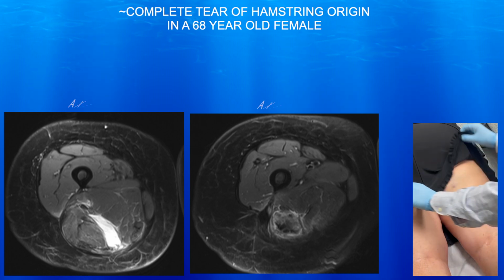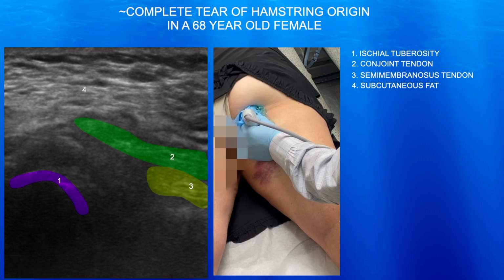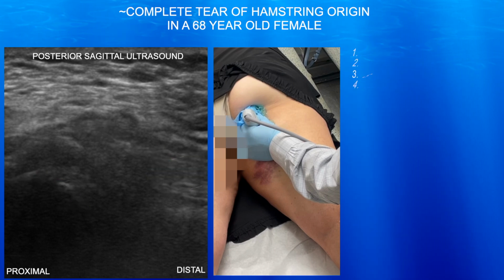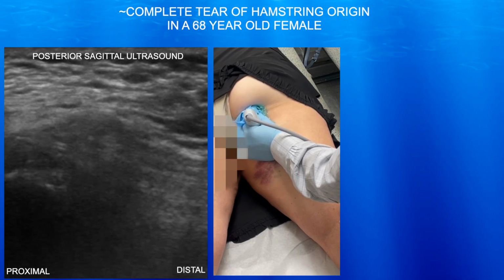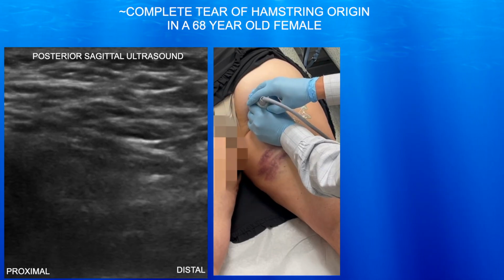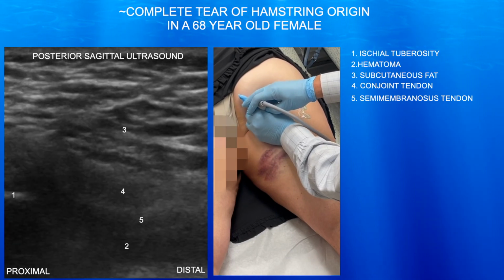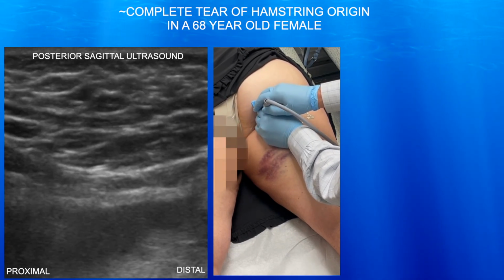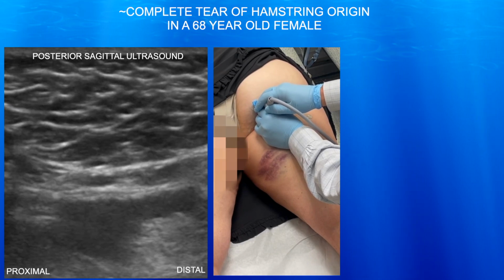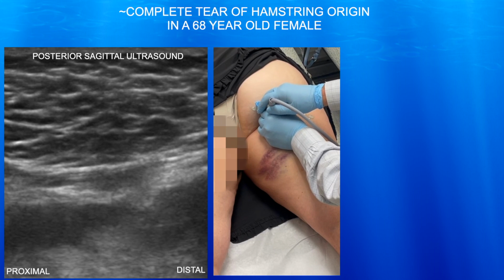ischial tuberosity. Here we're looking at the ischial tuberosity in a sagittal plane. You can appreciate essentially this bogginess of tissue around the ischial tuberosity. You could see some fibers of the semimembranosus tendon and conjoint tendon, somewhat distal to the ischial tuberosity, but it's really hard to see any attachment of fibers. Here again, you see just anechoic and hypoechoic signal around the ischial tuberosity consistent with tearing. Here you see a pretty large anechoic area consistent with a hematoma secondary to this muscle tear.